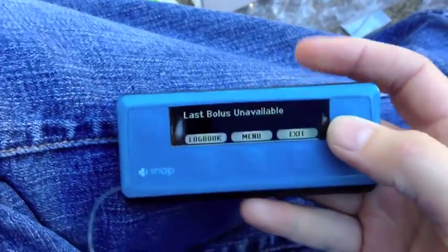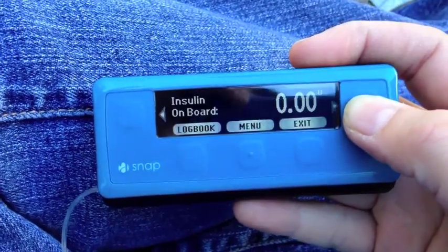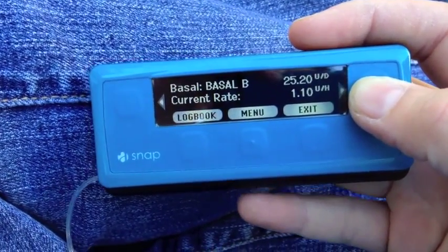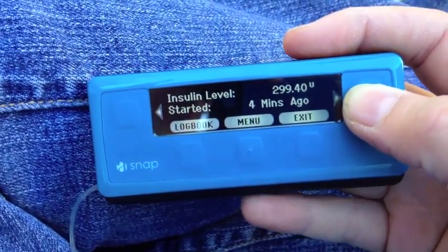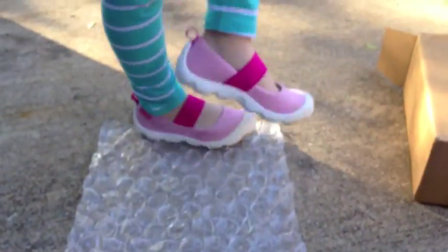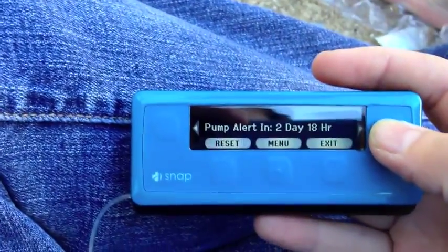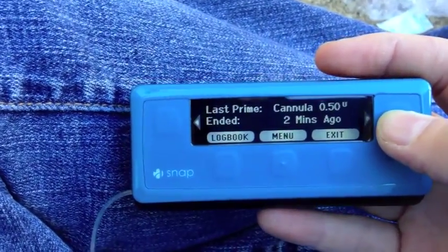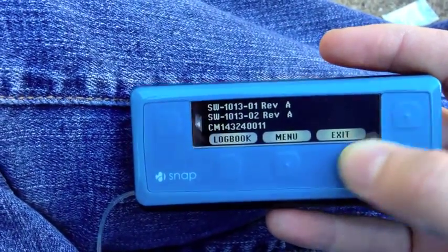The status screen. Right now last bolus is unavailable because it's a new pump. So: insulin on board, current basal rate, how much insulin I have left, when I started it. I have my pump alert set to remind me to change my cannula every two days and 18 hours. That tells me what my last cannula prime was, time and date, software version.